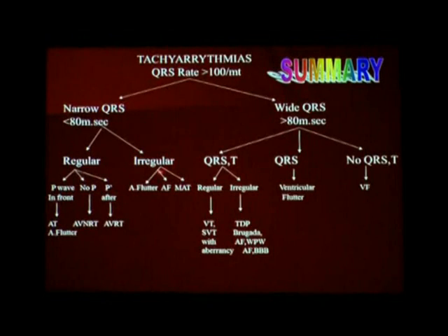If P waves are replaced by a fibrillary wave, and the RR interval is totally irregular, then the diagnosis is atrial fibrillation.